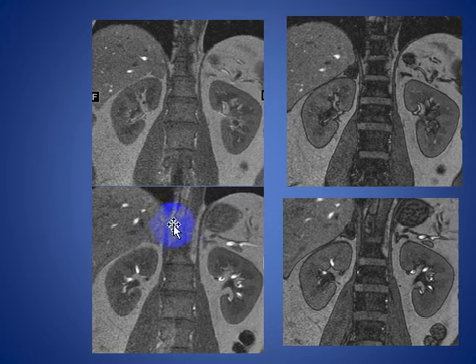Here, this patient has right adrenal mass. This is the in-phase, and this is the out-of-phase, and in the out-of-phase, the mass becomes more low attenuated than in the in-phase. It is consistent with adrenal adenoma.